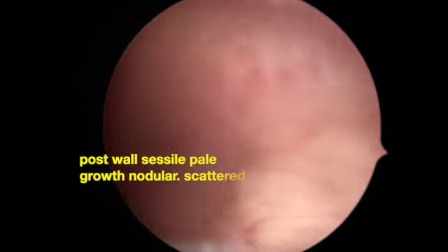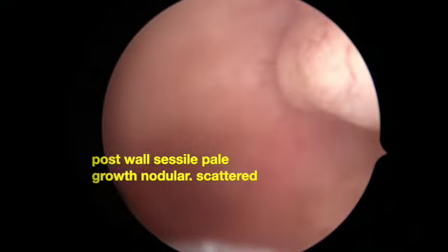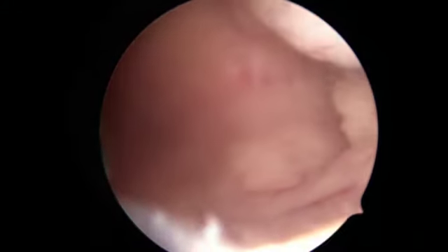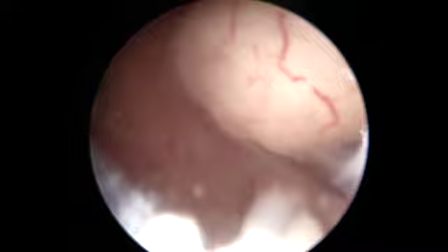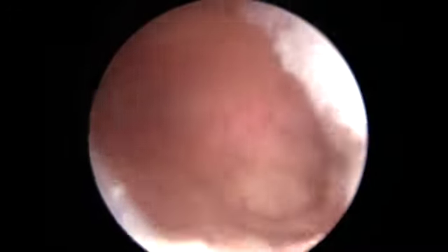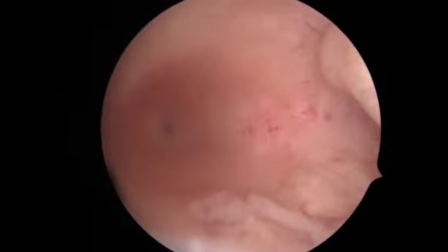using the Betoki 5 scope. On the posterior wall, as we mapped the cavity, we see sessile lesions scattered towards the left ostia, and a polypoidal nodule, not a polyp, because you cannot see any glands on the polyp, with a smooth surface seen arising from the fundus.